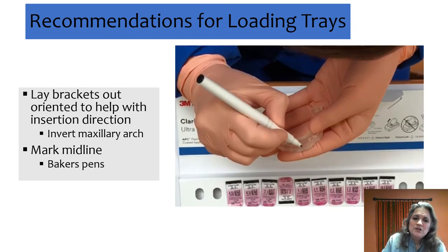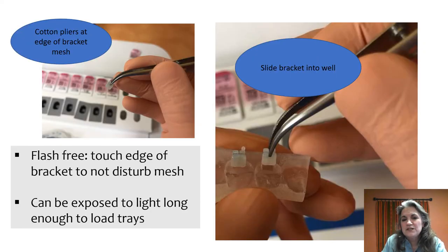In our lab, for the maxillary arch, if you invert the brackets it's an easier process — remember you're putting them into the tray upside down, and that seems to really help. We also like to mark the midline, and we've found an effective way to do that is to use a baker's pen, which is really just a food color pen that bakers use for decorating cookies and cakes. The nice thing is you can also wipe off the tip if you need to.